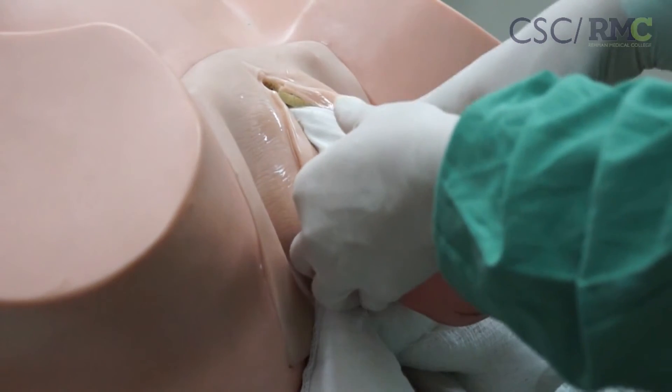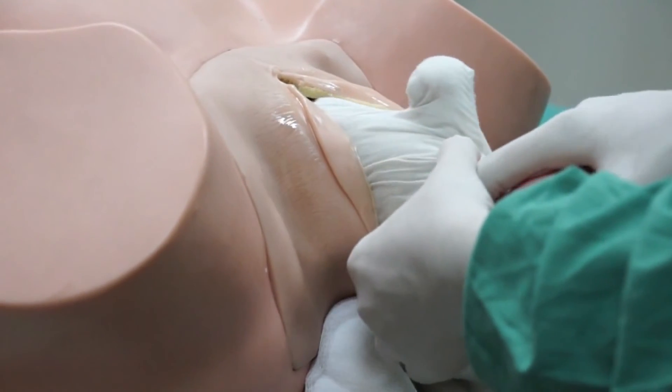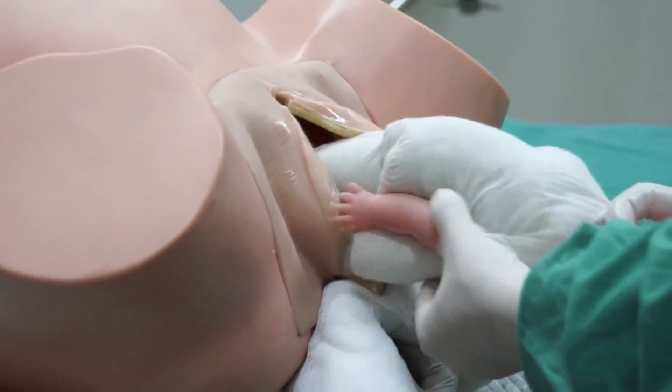After the baby's head has delivered, pull the baby downward and posteriorly to assist in the delivery of the baby's body.